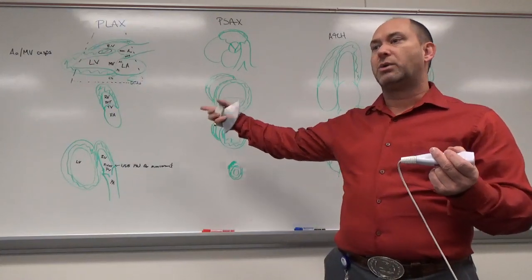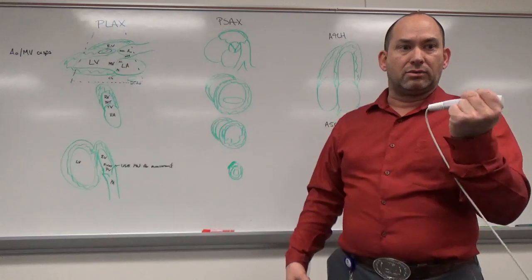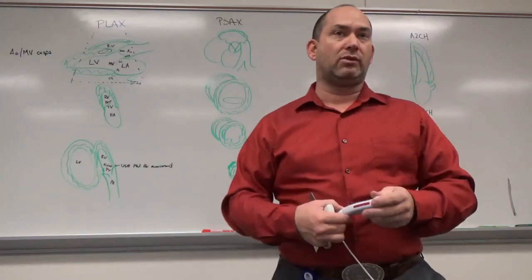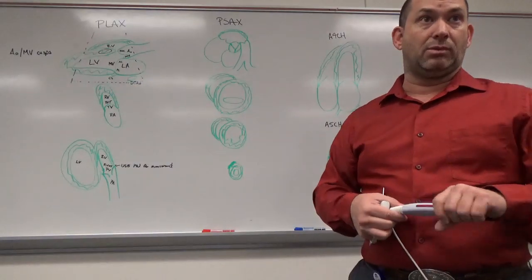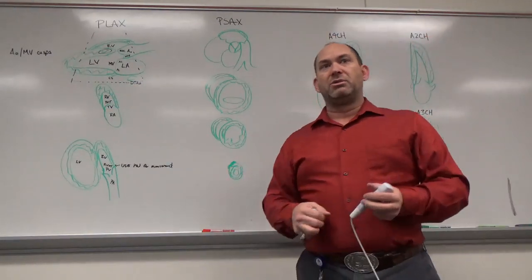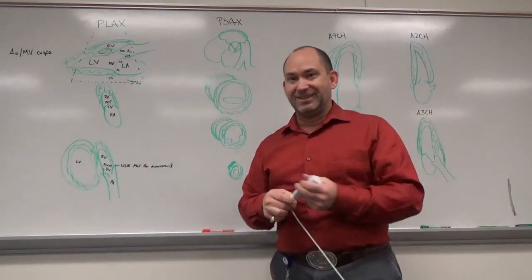Instead of trying to inch my way through and wasting a ton of time while I tense up all my muscles trying to hold that transducer. So for me, that's a very quick motion. Tammy said she does the exact same thing. Other sites may say, don't ever use your other hand. Whatever, if it doesn't hurt you, that's good.